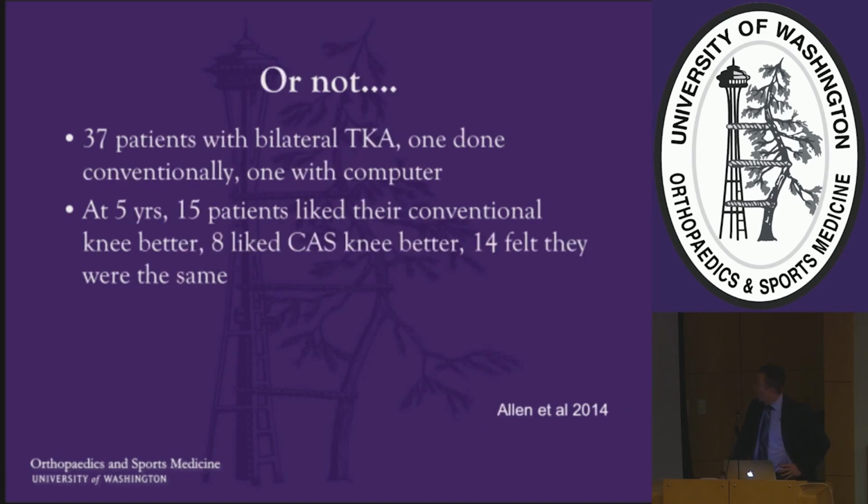Or not, actually. When you ask the patients, it doesn't seem to make a lot of difference at all. This is a study that was done recently using the same implant on both sides, bilateral procedures. The first procedure was done with the computer, the second procedure was done with the conventional system. And what they found was that at 5 years, 15 of the 37 patients liked the conventional one better, 8 liked the computer-assisted one better, and the rest of them didn't care one way or the other.